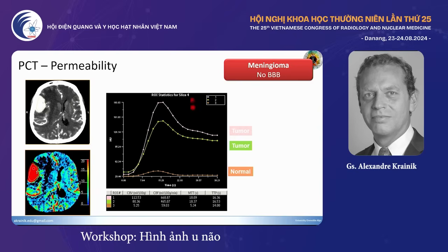Of course, when you look at the image, what kind of tumor is that? No trick. Meningioma, okay. It's a large meningioma, and in meningioma, no brain-blood barrier. It's not intraaxial, it's extraaxial, and you don't have this brain-blood barrier. Then the bolus leaks normally out of the vessel. Anyhow, when you scan the patient and you do the first calculation, you see there's a very high perfusion, then, well, it's a meningioma, no problem.